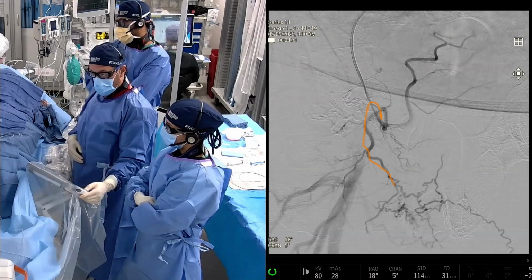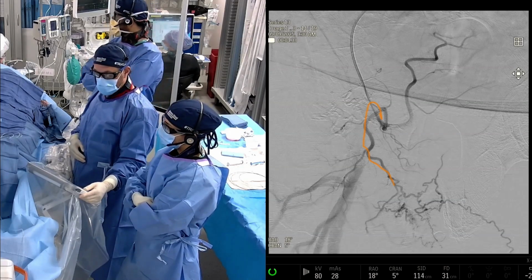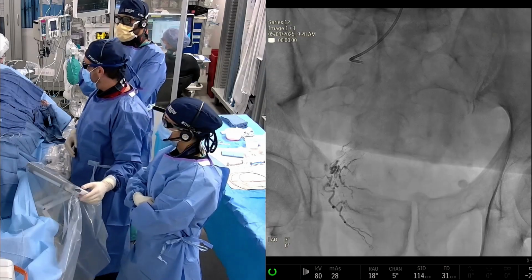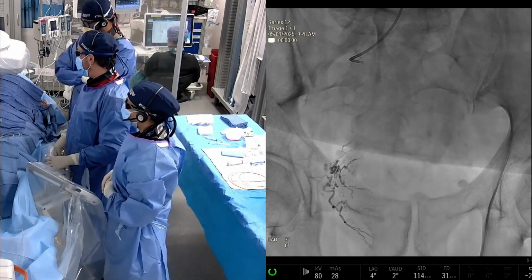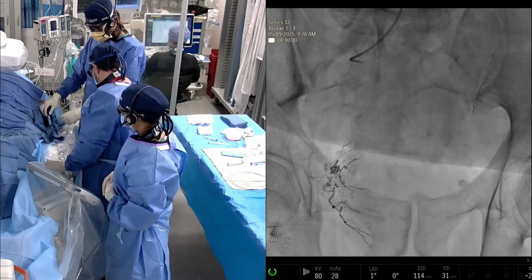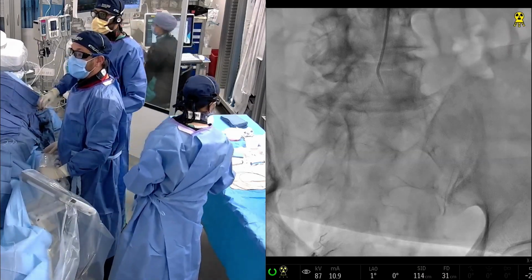We just wanted to do it without any obstruction in terms of our visualization. So sometimes we do that. Do you guys, in patients that have catheters, replace the saline with 50-50 or something like that? Not anymore. I don't mess with it. We used to do that back in the day, but we don't do that anymore.